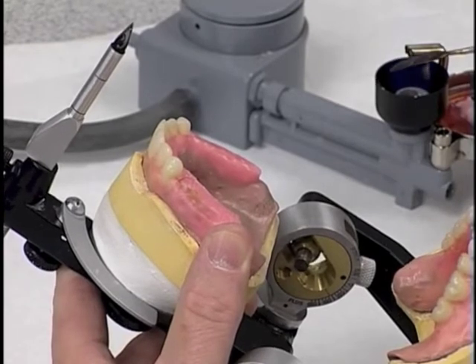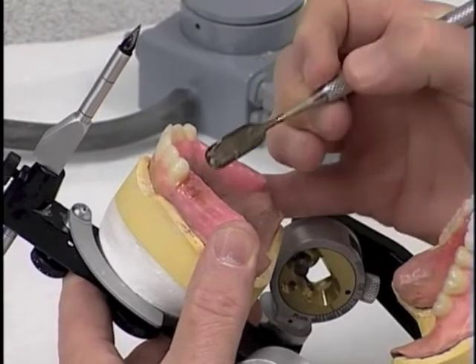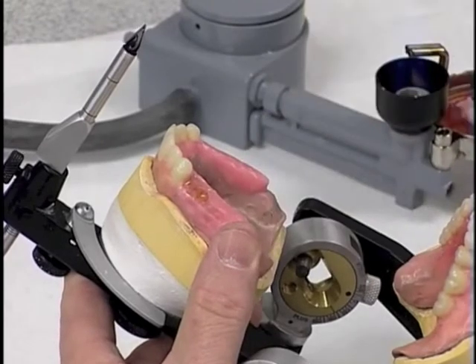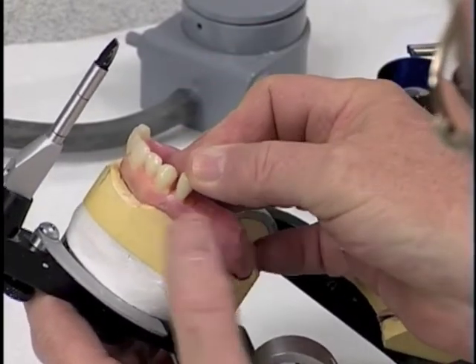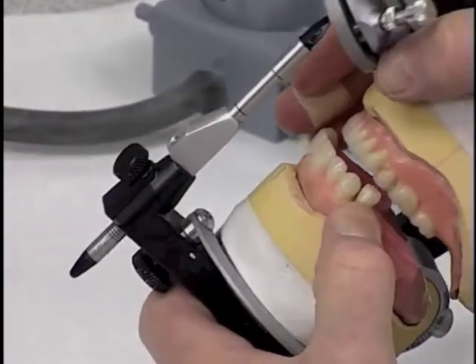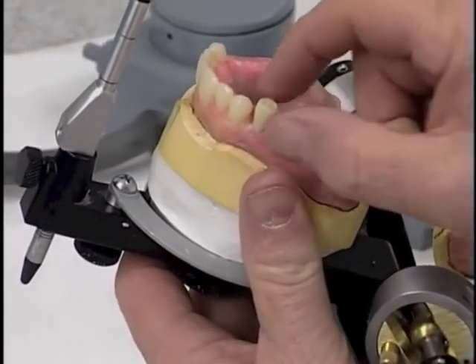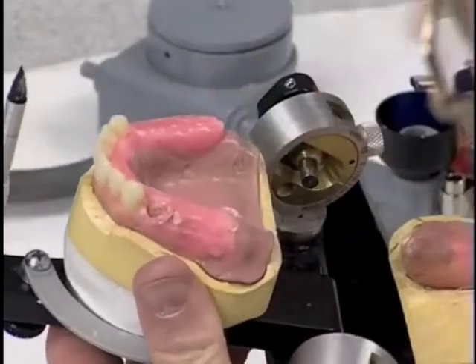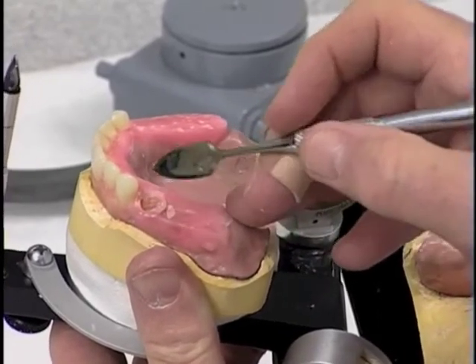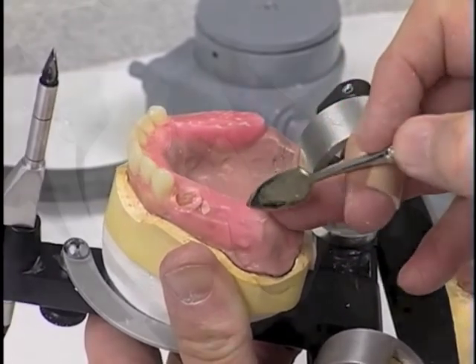So we're going to start by pooling the wax, softening the wax in the area where we want that maxillary premolar to be. And then we place the premolar in its position where we think it should be, and then try to occlude it and see what happens. And as we can see, I have the tooth out too far and not down far enough, but as we can also see, I'm running into base plate. So what I'm going to have to do is to cut a window for these teeth in this side.